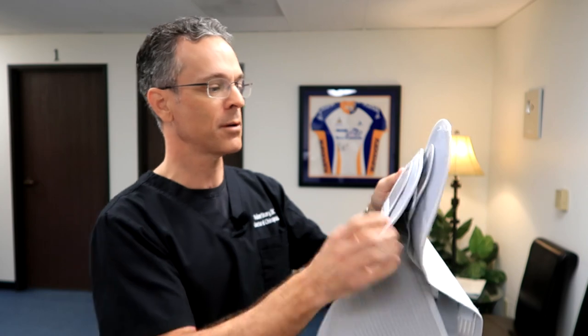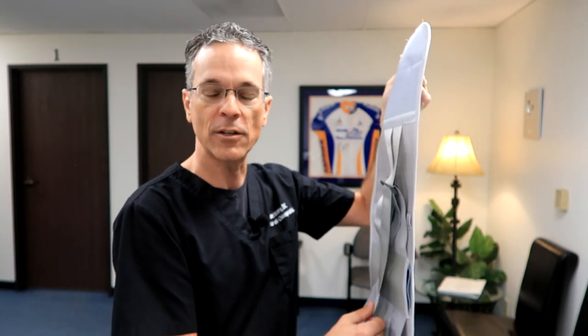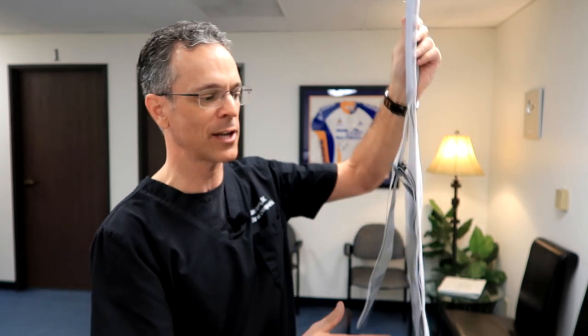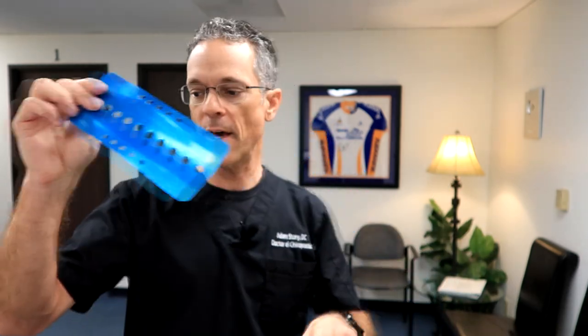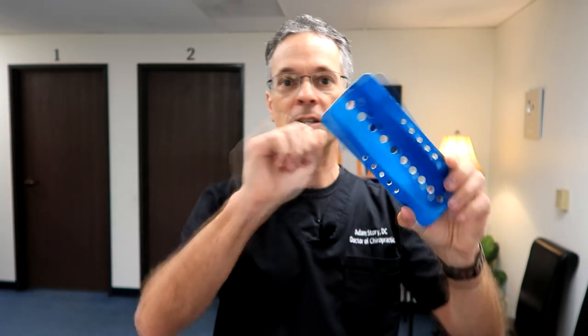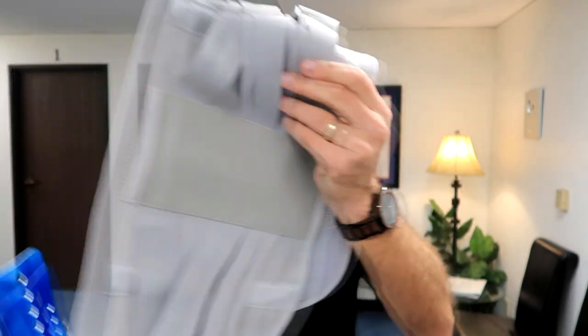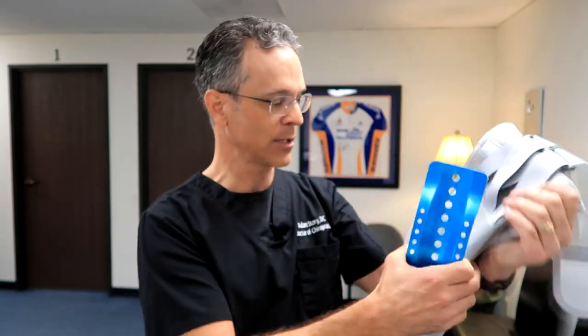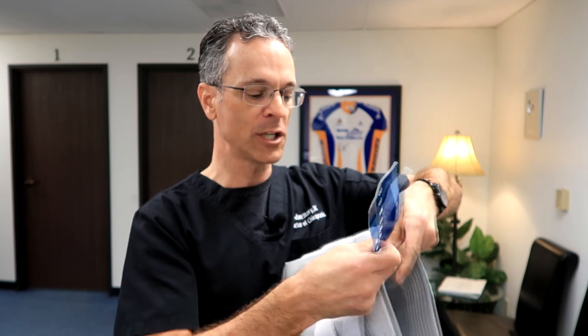There are important components to this. The first is it has these removable pieces — that's the main thing you want to look for in a quality back brace. This is not just a one-size-fits-all. In the middle it comes with this metal plate. This is hard as a rock and you can see the curve in it. You place this inside the back brace along the back, and this is what allows good support for the person's back.